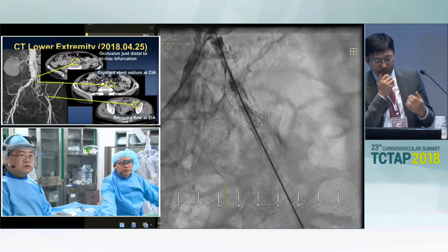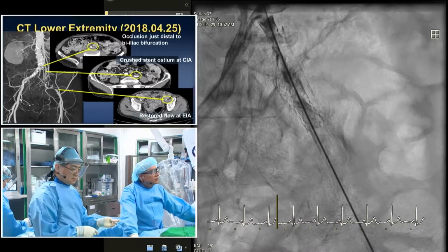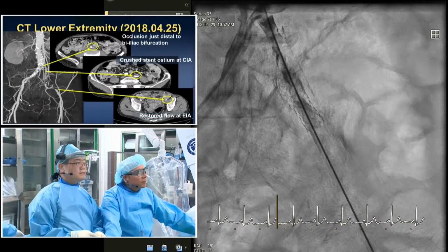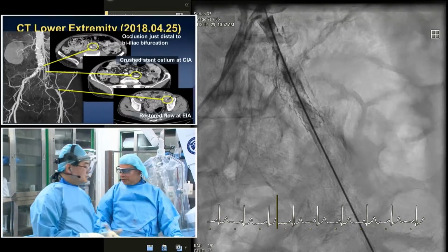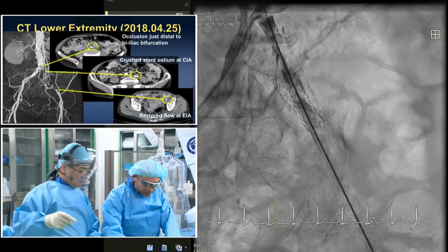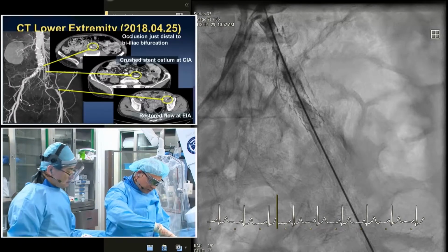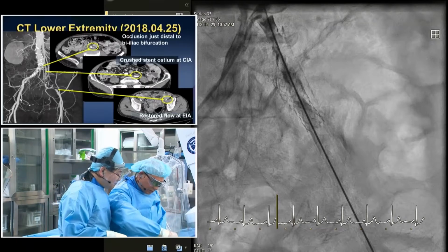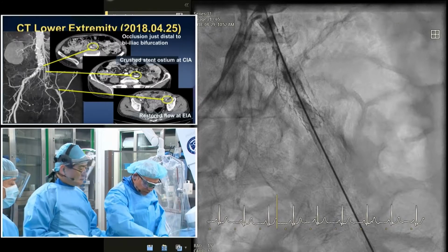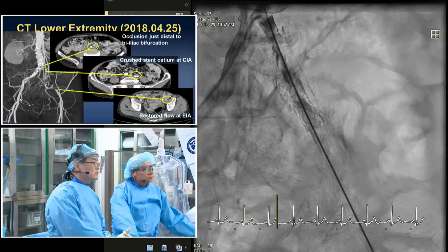Seeing this, my opinion would be to take care of that distal portion first, go distal to proximal, because you have slow flow and a lot of intimal disruption. You need to tack that to make sure that nothing embolizes or that the dissection doesn't extend before you finish proximally. From a safety standpoint, I would do the distal first, and then the proximal is no issue after that. That technically could be more of a challenge for you, I don't know, because it's so close to the sheath, you have to retract the sheath and so forth.